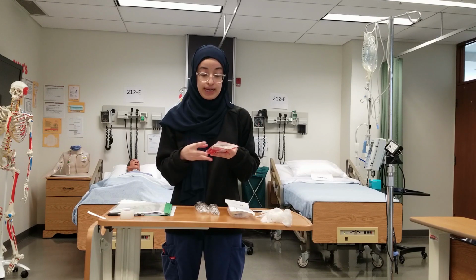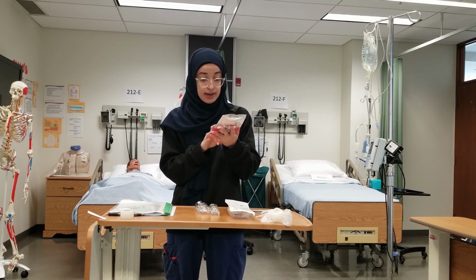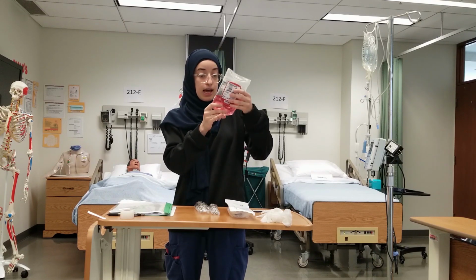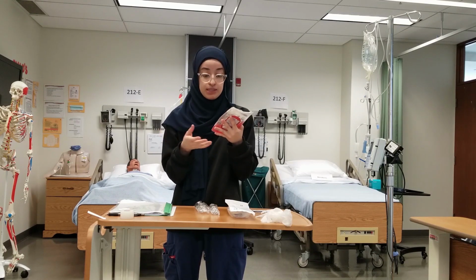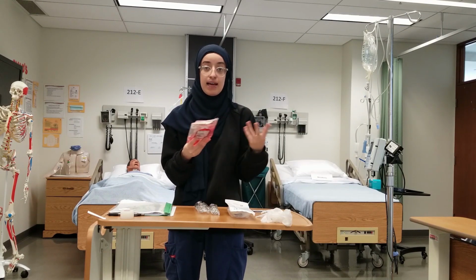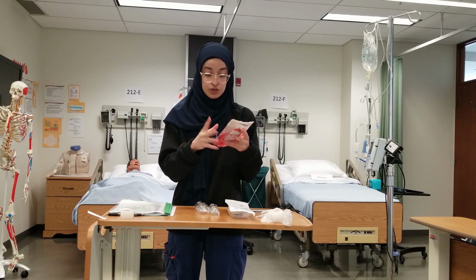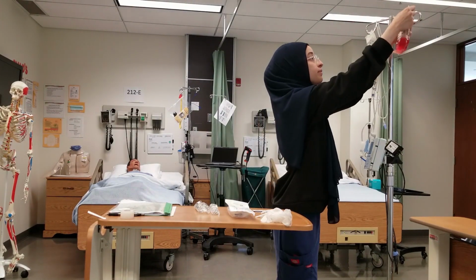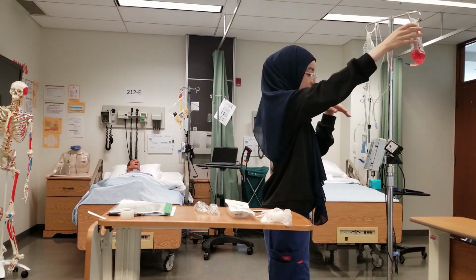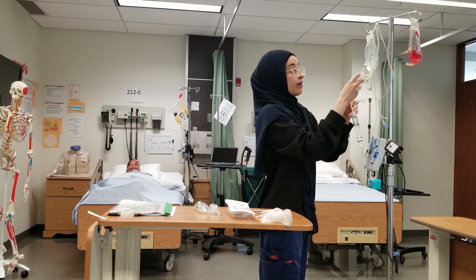I want to make sure that when I get the blood bag, I see if it is clear, if there's any leaks, the expiry, any additives, etc., before I give it to the patient. If I receive a bag and it's coagulated, I definitely don't want to give that to the patient and increase the risk for blood clots. So I have my blood, I'm going to go to my patient's room. I'm going to hang my blood, and then with the other side of our Y tubing, we're going to spike the bag.